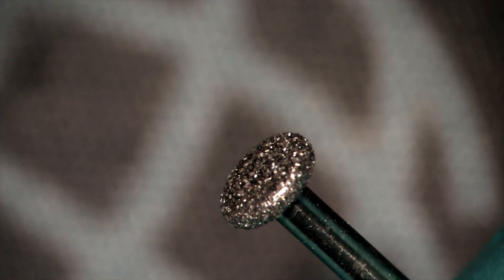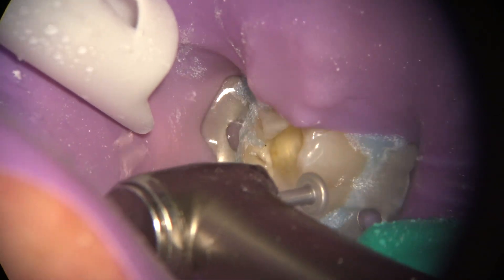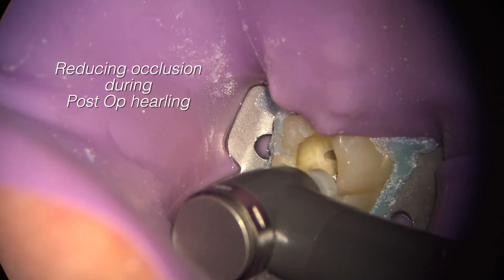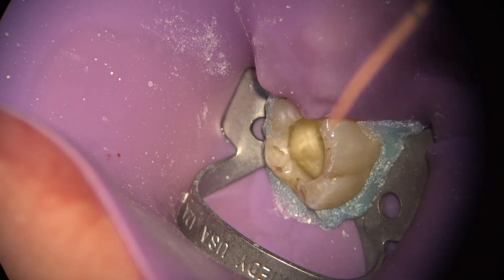The next burr in the kit is the flat diamond, which I use to flatten the occlusal plane during access preparation. This helps reduce post-op pain as well as creating a flat surface for measurement of the reference point. This is done only in cases where complete occlusal coverage will be provided after root canal therapy, in the form of a crown or an onlay.